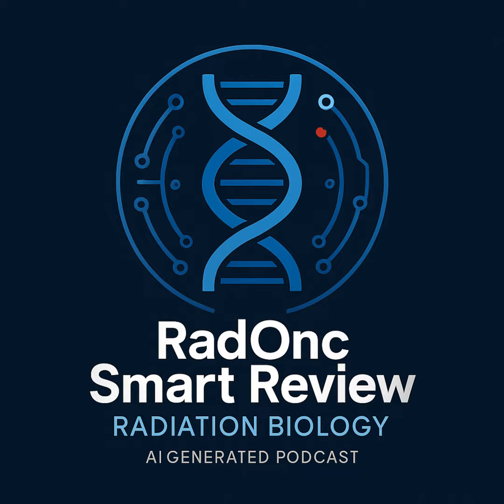That's the anatomical side. What about the PET scan impact? PET scan, especially FDG PET/CT, is now standard of care for staging so many cancers. It routinely finds metastatic disease, maybe in lymph nodes or distant organs that we just wouldn't have seen on CT alone. And finding those mets can totally change the treatment plan, right? Maybe from curative intent to palliative? Absolutely. It prevents futile local treatment sometimes. But even for curative cases, FDG helps refine the target volumes. That metabolic GTV often gives us a better idea of the true extent of active disease than just the CT abnormality.